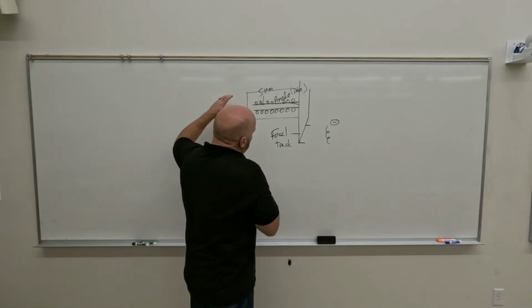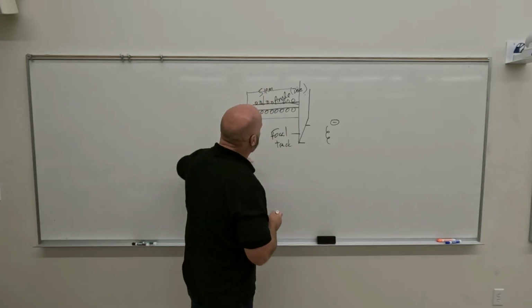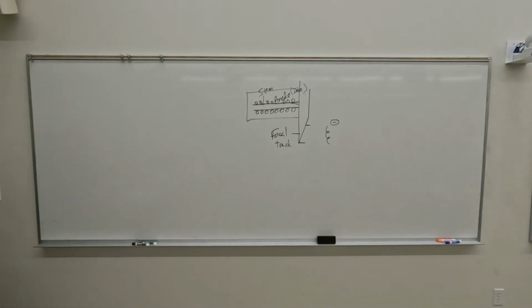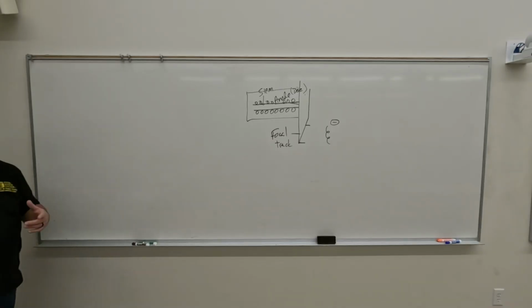So it slips over the outside of that glass, and if you look on page I'm in the wrong chapter. If you look on page 119, Bushong shows you kind of a diagram of what the induction motor kind of sort of looks like.